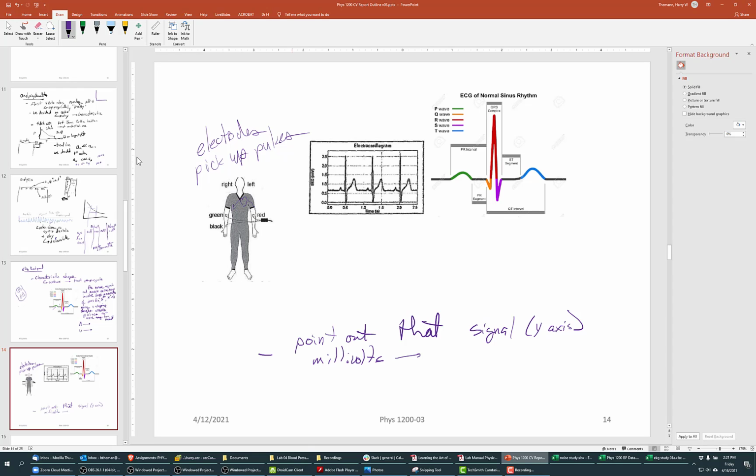The P wave? Well, each of these arrives. Yeah, this is earlier in time. That's later in time. So the P wave arrives, then all these different parts arrive, and the electrocardiogram just records the voltages. And this is where you say, well, heck, notice that the amplitude, the height of these things, is in millivolts.